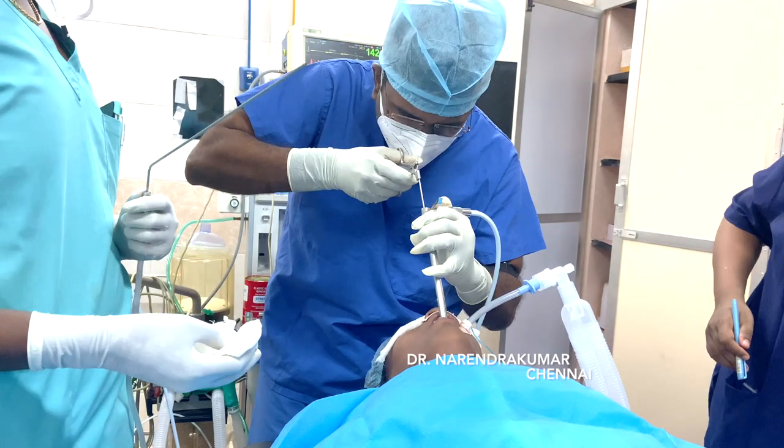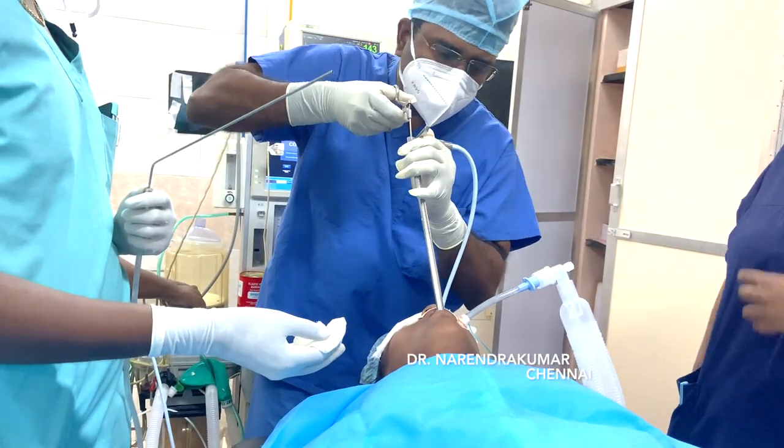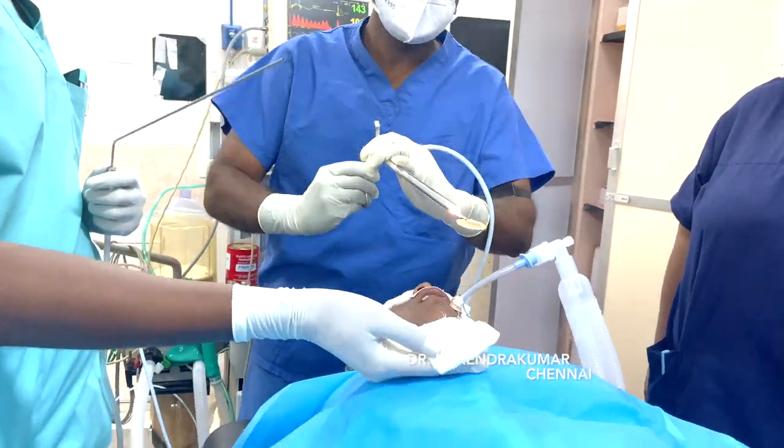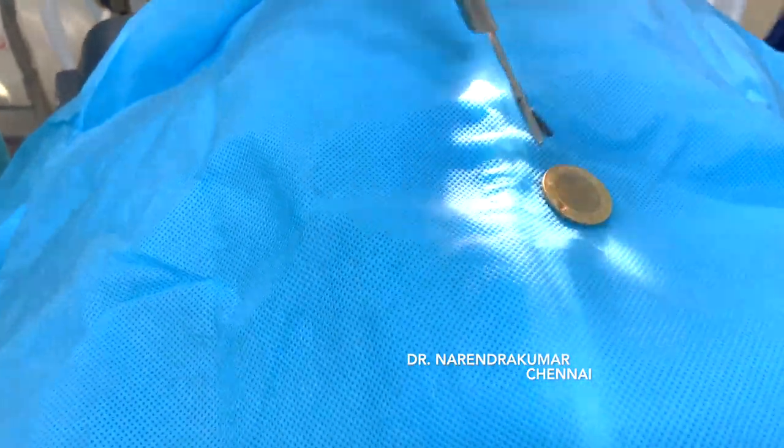Remove the coin along with the scope — that is very important. You cannot take it inside the scope, so remove it together with the scope. You will see the large 10-rupee Indian coin coming out.